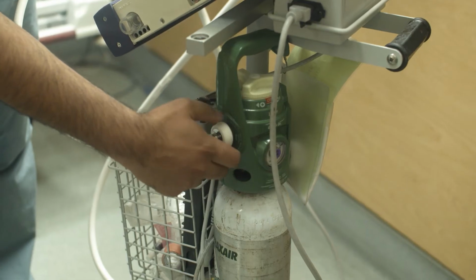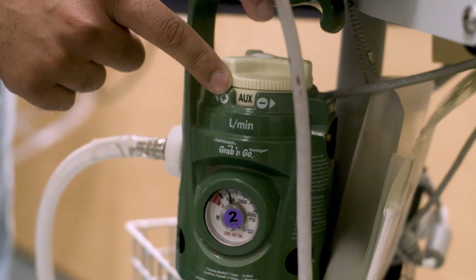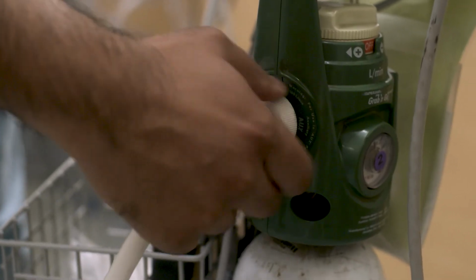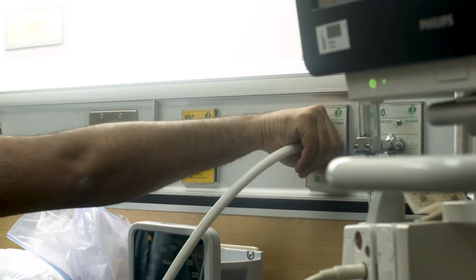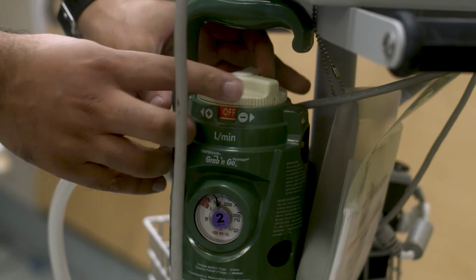If you have to use the attached oxygen tank, make sure it is full by looking at the dial. The oxygen flow should be set to auxiliary for use with the ventilator. However, with high FiO2 requirements, your tank won't last very long, so you must plug it into the oxygen port on the wall as soon as possible. It's a simple screw-on port, so if you do use the wall port, make sure you turn the O2 tank to off, as some gas will leak when on the auxiliary setting and you'll drain the tank.